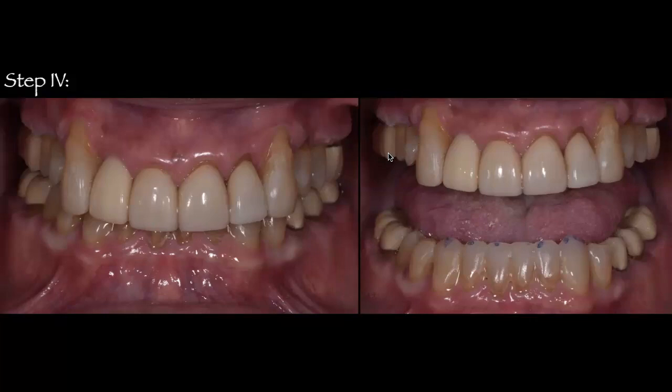Now, because these teeth are healthy and you have reduced 80% of the force of contraction of the elevator muscles because your posterior teeth are not in contact, that is how we allow this effect to work without creating any damage to these anterior teeth. So this is what you're seeing. Step number 4, we're done with our prototypes on the mandibular arch and the maxillary teeth. We've created a new anterior guidance.